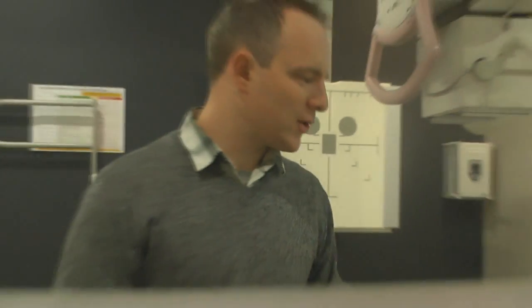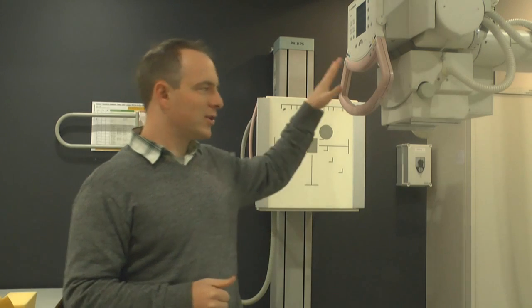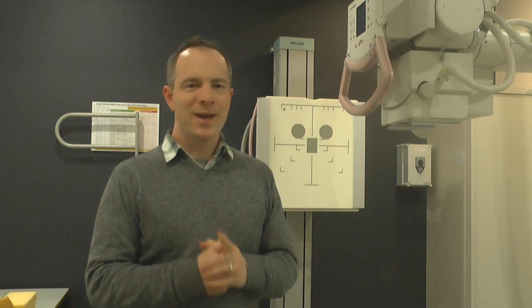So why do we want to measure dose? Well, obviously dose is very important for the patient, but it's also important for keeping you safe and for designing radiation safety for the whole environment that we're in. Also, it's very important for the detector itself. So really what we're measuring is not only the dose to the patient, but actually to the detector itself as well. Many detectors have a lot of electronics in them that need to be shielded and protected from radiation, which can damage the electronics as well. So measuring dose is important for multiple facets.